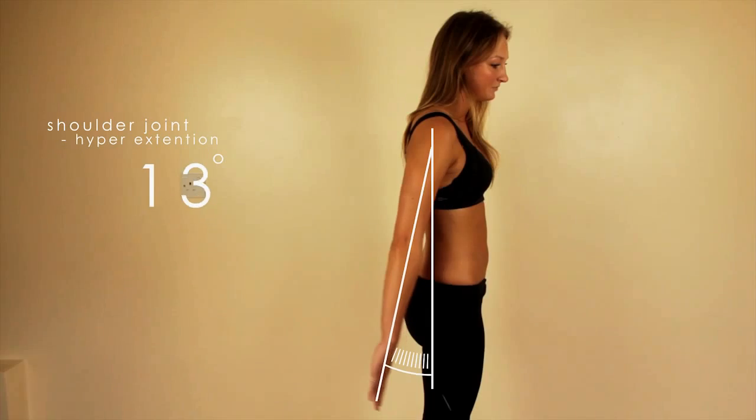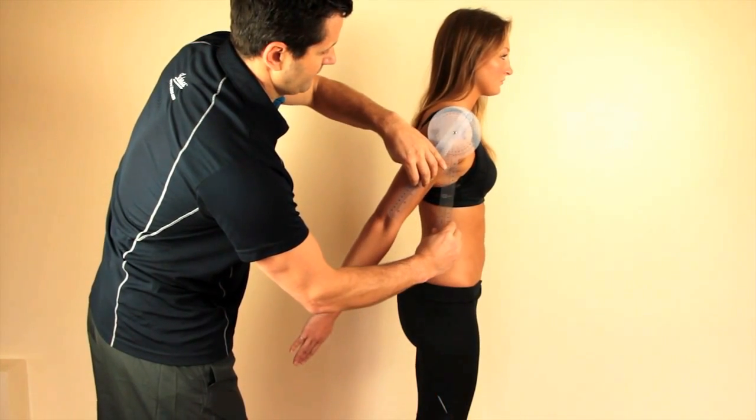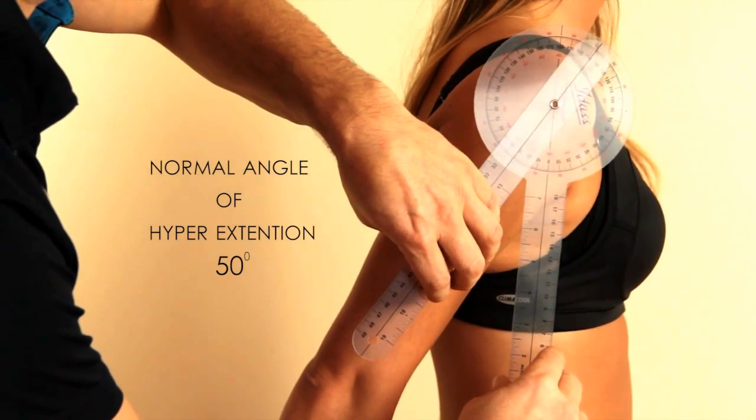Hyperextension of the shoulder joint. This is measured in degrees of backward flexion. Again, use the shoulder joint as a reference. The normal angle of hyperextension is around 50 degrees.